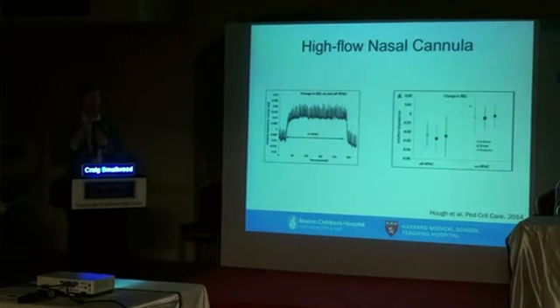They thought it was just washing out of dead space and just making your ventilation more efficient. Well, it also provides oxygenation support and can prevent some de-recruitment of alveoli, and this is basically demonstrating that that is the case with high-flow nasal cannula. So you can see here, no nasal cannula. They strap on the high-flow nasal cannula, crank up the flow, and you can see the end expiratory lung volume by global impedance increases, and then when you turn it off, it decreases.